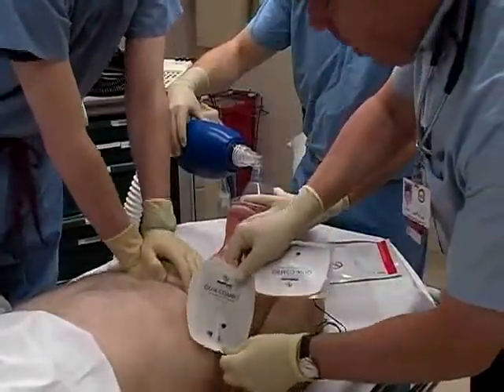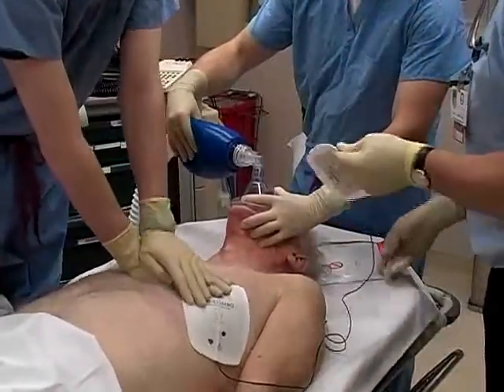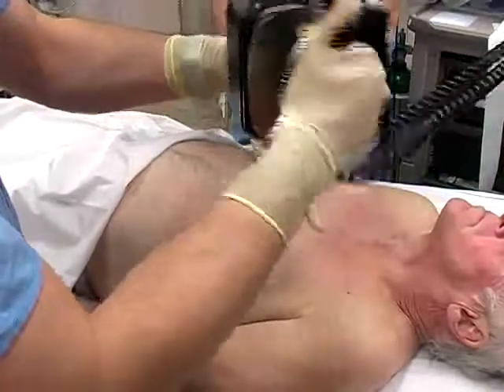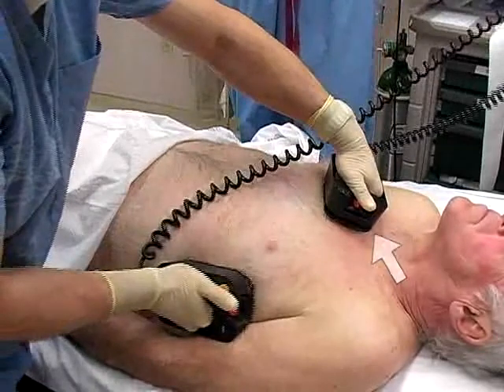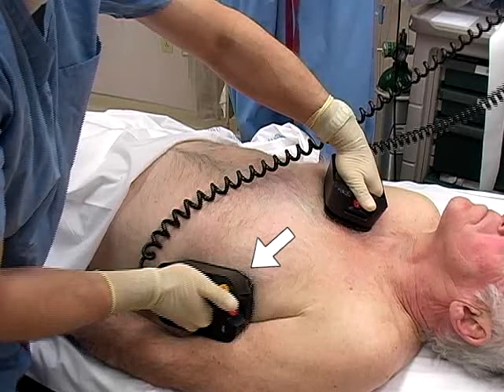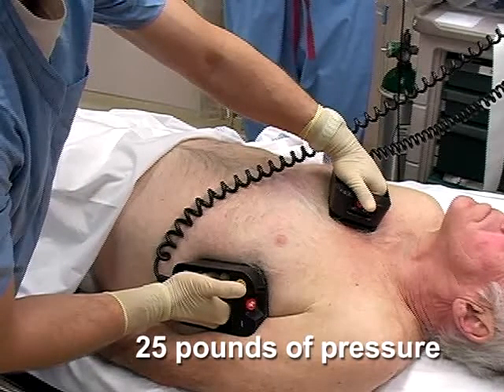Self-adhesive defibrillation pads are preferable for delivering countershocks, but if they are not available, the defibrillation paddles may be used instead. First, apply electrode gel and distribute it evenly along the surface of the paddles. Place the anterior paddle to the right of the sternal border in the second or third intercostal space, and the lateral paddle in the left mid-axillary region at the fourth or fifth intercostal space. Press down with about 25 pounds of pressure to ensure adequate contact between the paddles and the chest wall.